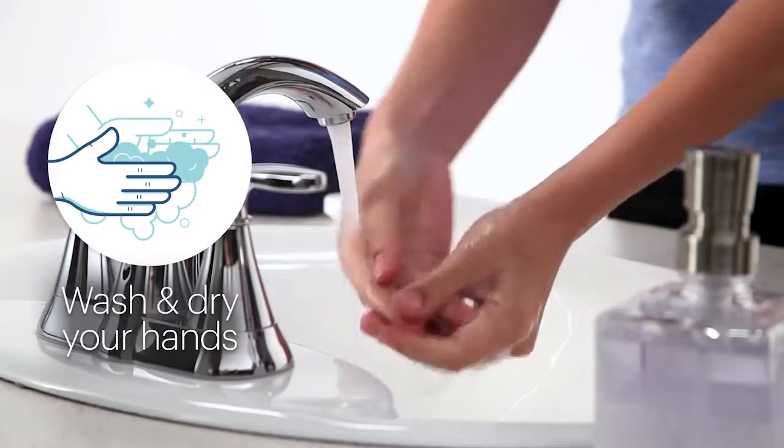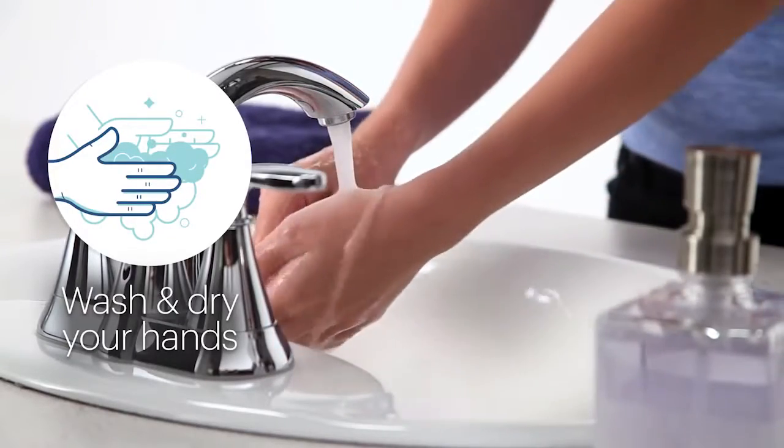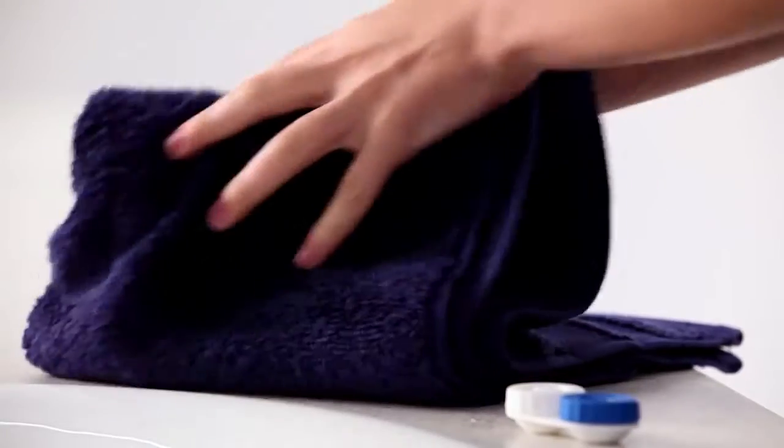Okay, let's get to it. First, always wash and dry your hands before you touch your lenses or your eyes. You definitely don't want dirt or germs on either.